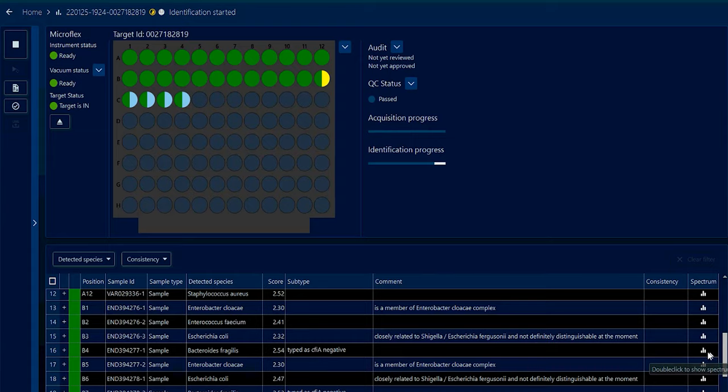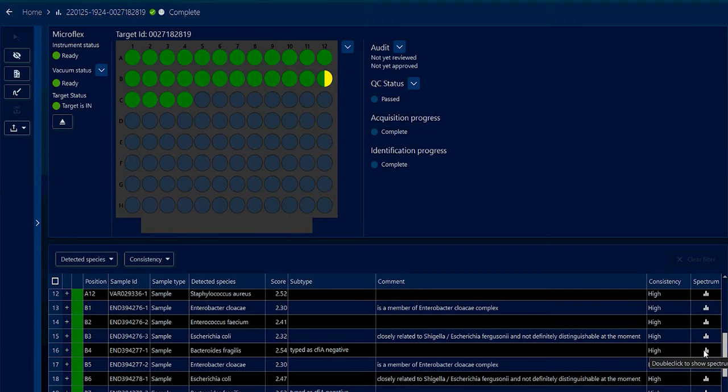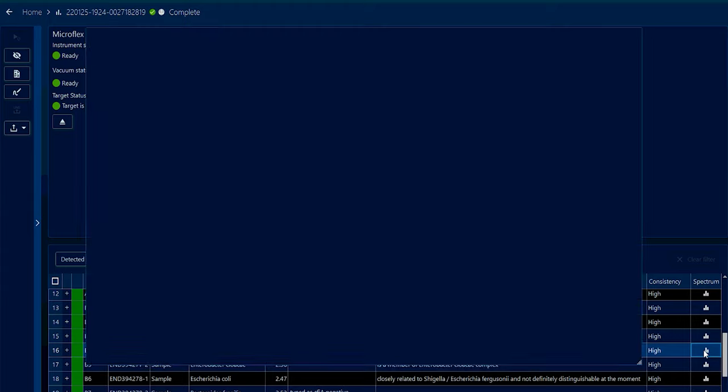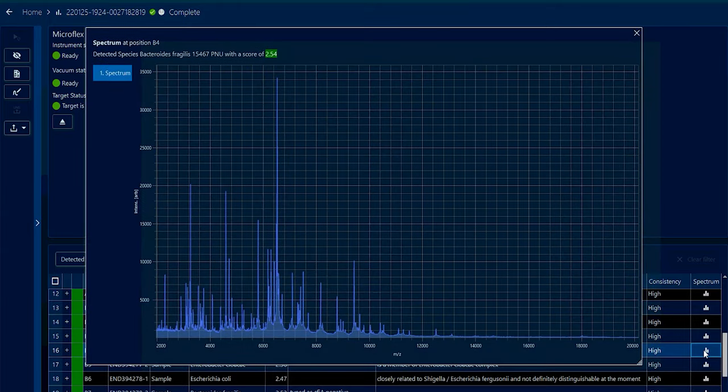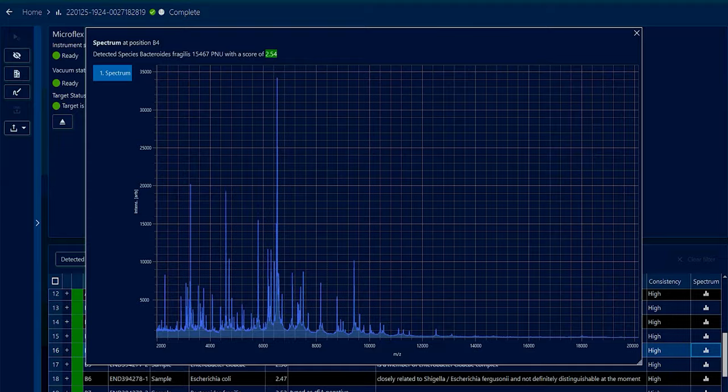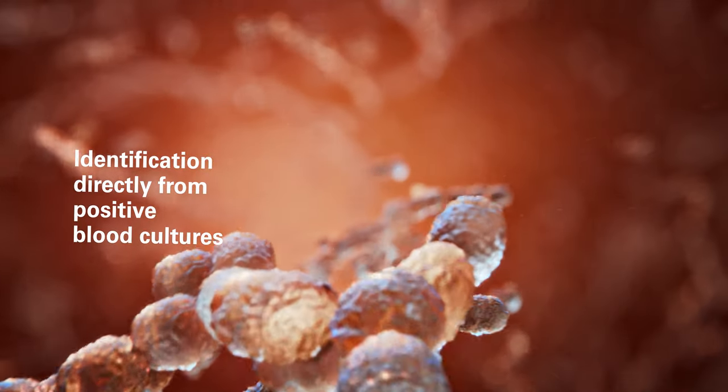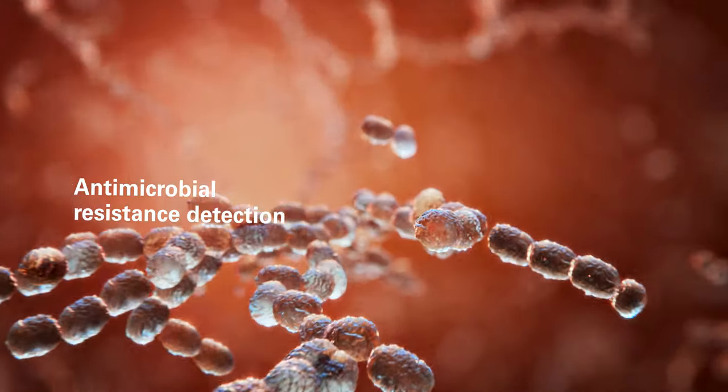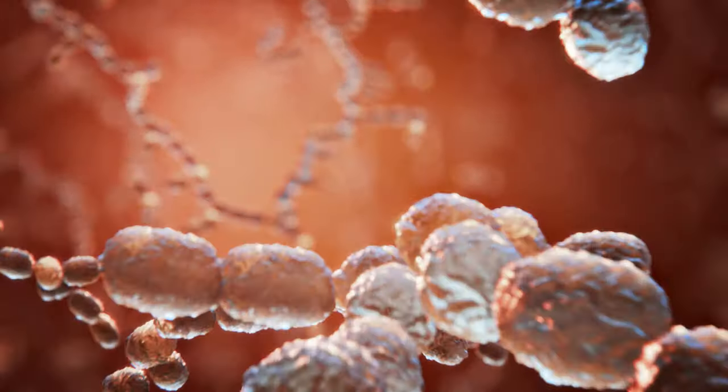In addition, Bruker's continuous innovations have brought MALDI-TOF beyond microbial identification from standard cultures. The MALDI Biotyper Sirius system offers tools that enable identification directly from positive blood cultures, antimicrobial resistance detection, or lipid analysis.